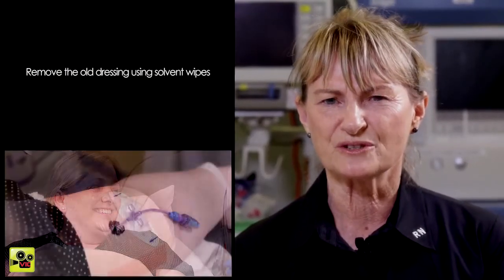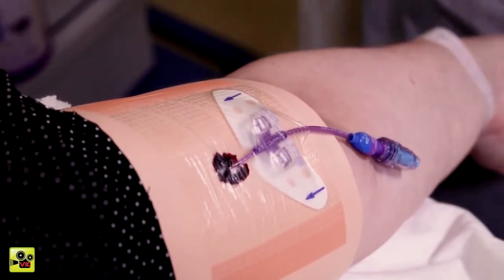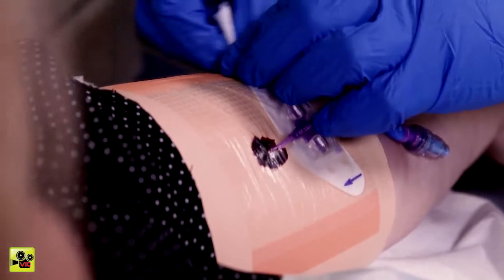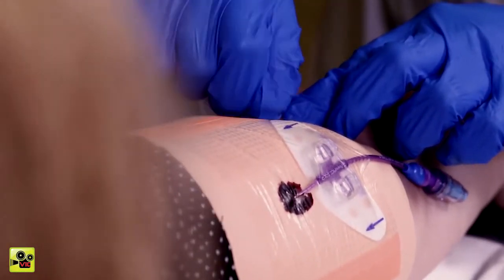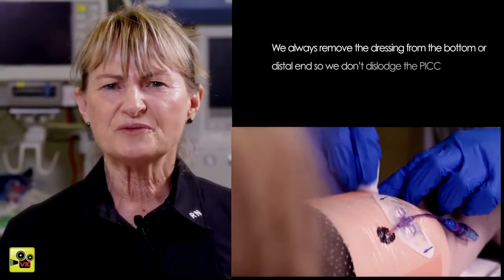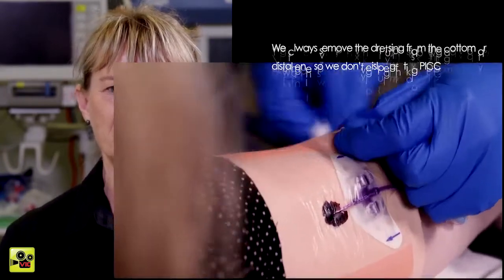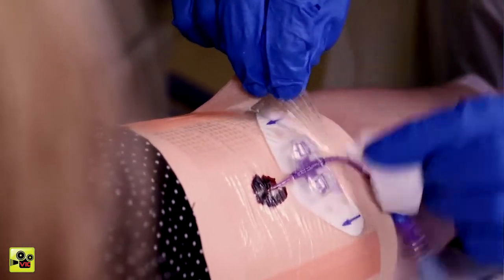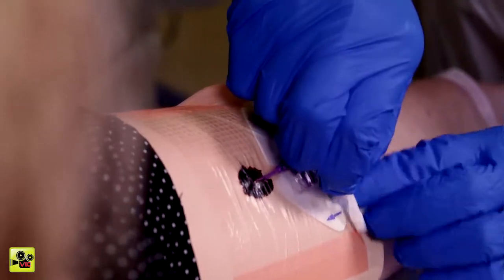Remove the old dressing using solvent wipes. I'm just going to remove the old dressing. It's a bit sticky sometimes, so I'm going to use a remover wipe. Okay. Is there any pain or itching at the site? No. It's all good so far. Let us know if there is any pain or itching. We always remove the dressing from the bottom or the distal end so that we won't dislodge the PICC. If there is, we can try a different type of dressing for you, so you don't always have to use this one if you do find it becomes an issue.